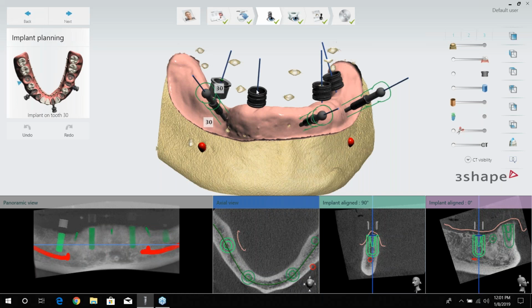And most of them, I would say, come off. As far as what it's going to look like, usually I think what's used is titanium dioxide, and so it's going to leave a white look on it. And then as far as the radiopaque markers, those can be pretty much any metal pieces of known size. I think BBs get used a lot, little ball bearings. But as far as how to use it, or how long you have to wait before you would place it in the mouth, that would all be specified by the manufacturer of that radiopaque material.